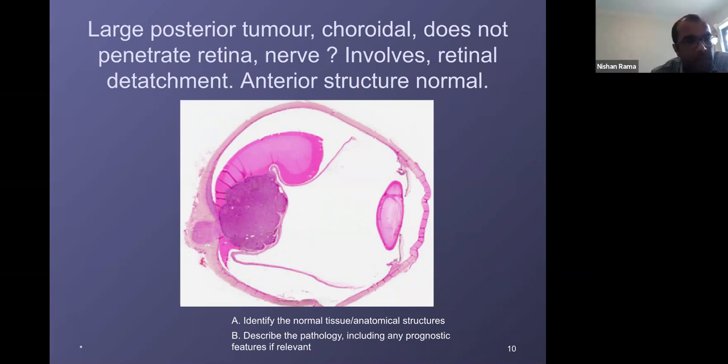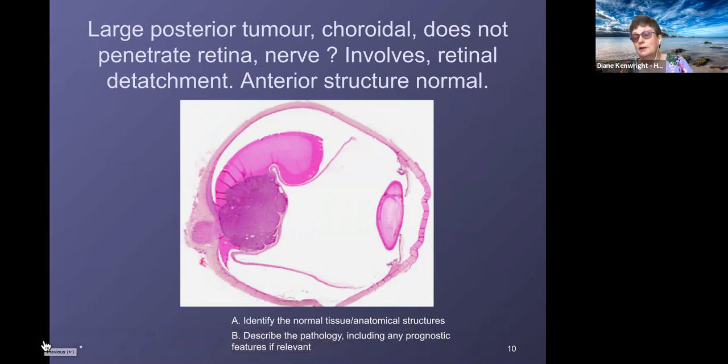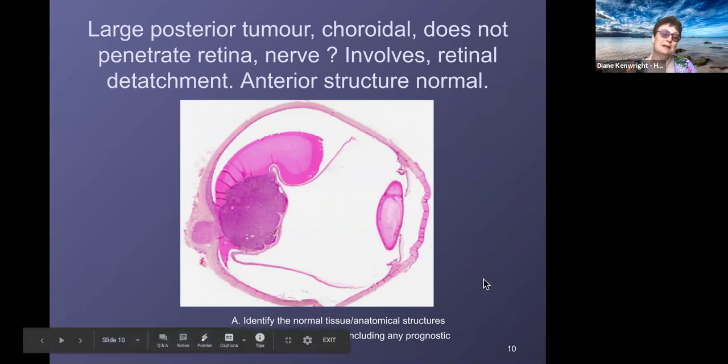Is that helpful? Yeah. So can you show me that photoreceptor thing again for the artifact? Okay, so you can't see it at low power. I will show it to you, but not at low power. I'll make a point of highlighting it when we come to a good example of something that's been artifactually taken out.